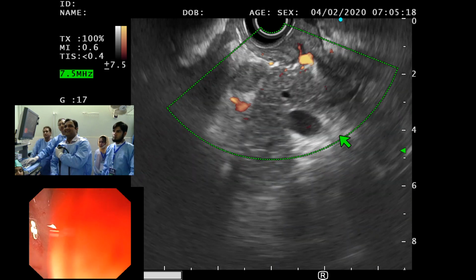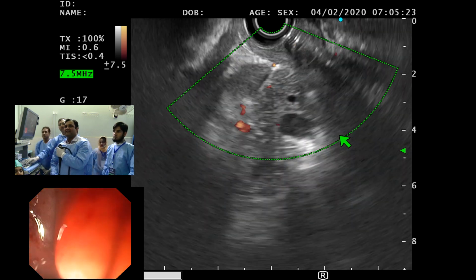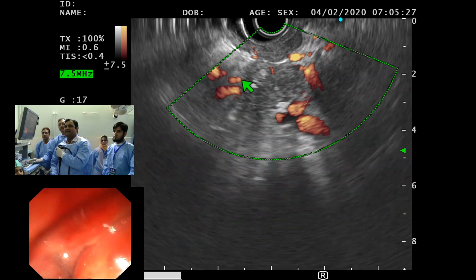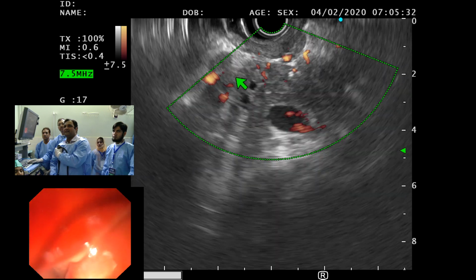Yeah, so that's the pancreatic. What do you want to see in the flow? We just wanted, the audience wanted to see the duct and the. Well, this is the pancreatic duct. This is the portal vein. These are the other blood vessels which are around the pancreas.